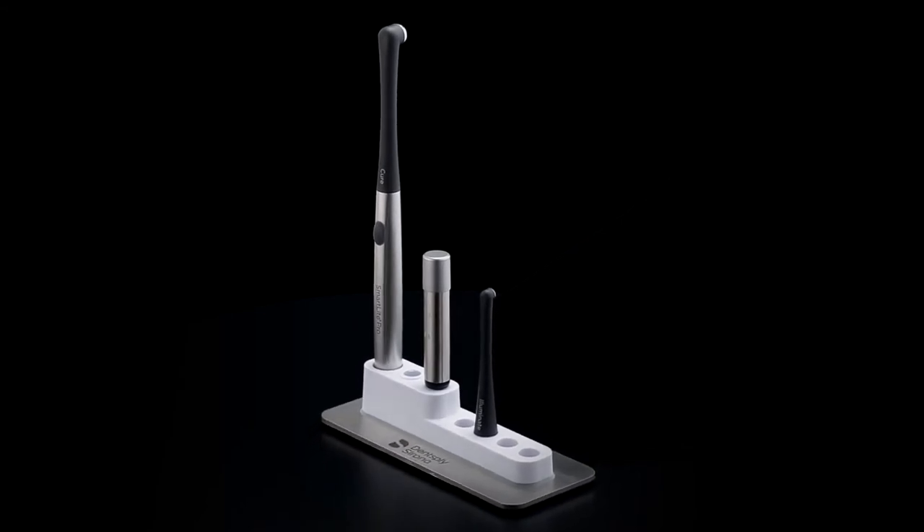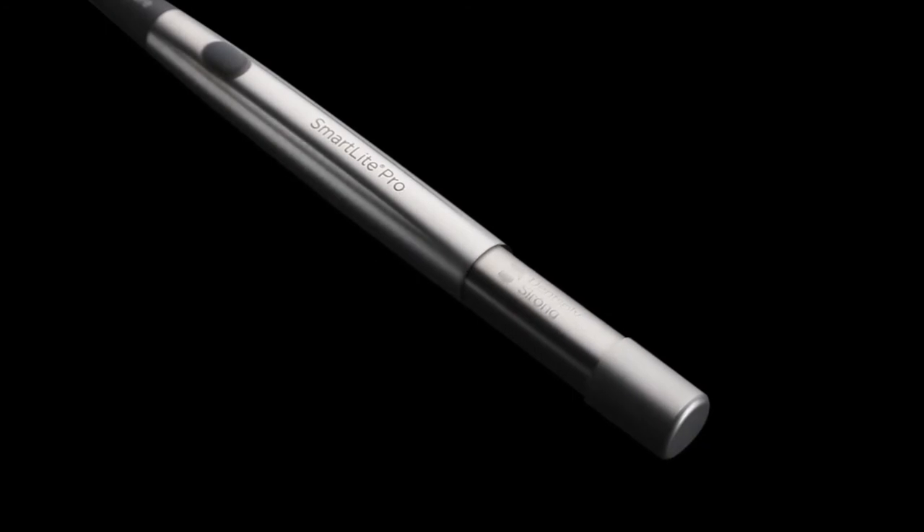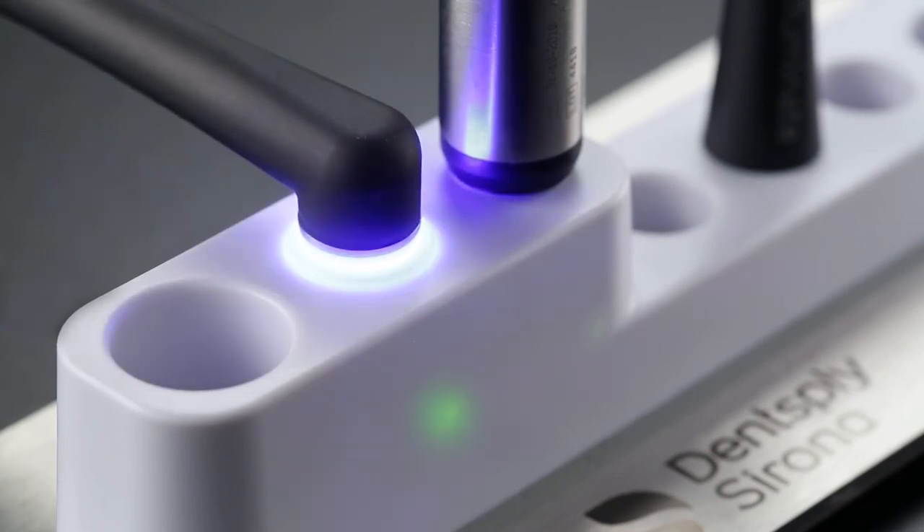The base also keeps the second battery charged. With the latest battery technology and an intelligent backup system, SmartLight Pro is always ready when you need it. There's even a built-in radiometer to ensure the right amount of curing energy for predictable clinical outcomes.